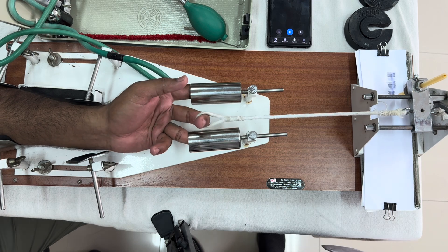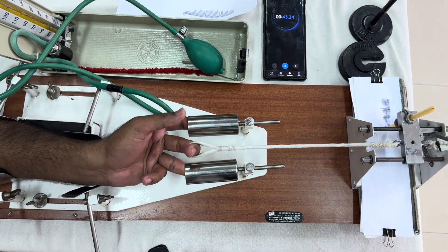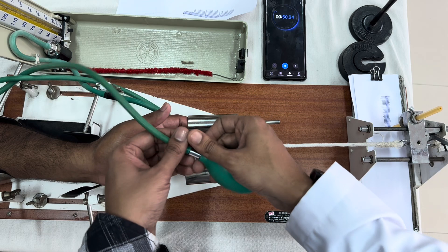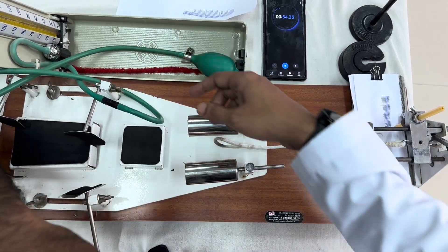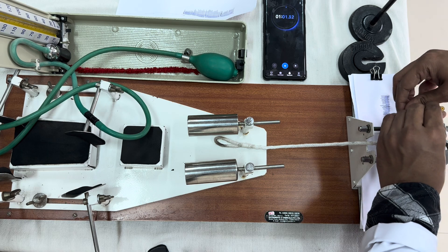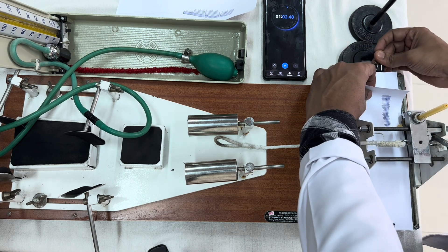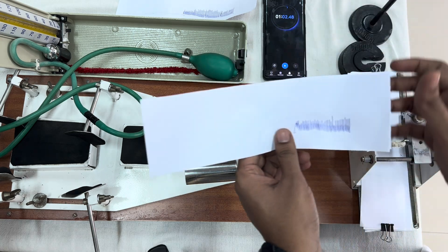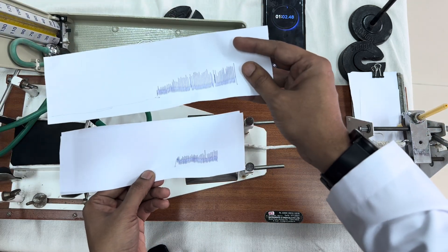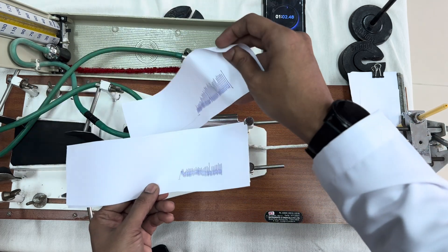We need to see the duration as well. Earlier it was one minute and six seconds. Now the duration is reduced and the total capacity is also reduced. Now the person has stopped. Immediately deflate the cuff and bring the pressure to zero, then remove the cuff and let the person relax. The recording showed it was just 44 to 45 seconds — the duration was reduced. This is the normal graph and this is with venous occlusion. You can see the height of contraction is reduced and the duration is reduced. The work done by the muscles is also reduced when the veins are occluded.